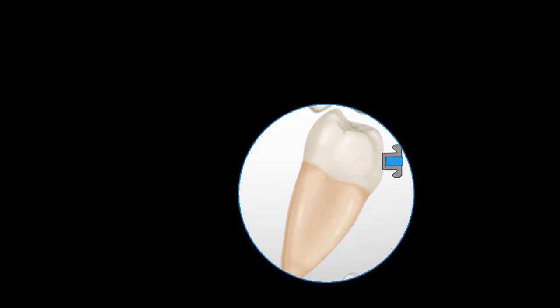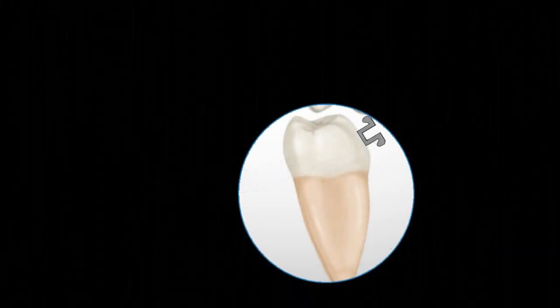So what was the solution when you were using standard edgewise brackets? The solution was to give torque or twist in the rectangular heavy wire which you are giving at the finishing stage of treatment. Now just assume that you have given minus 30 degree torque in the wire segment which will go into this molar, and because of that twist, the wire will not apply any force and it will not change the torque value of this tooth.